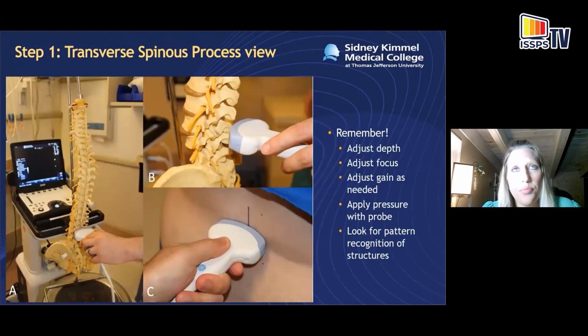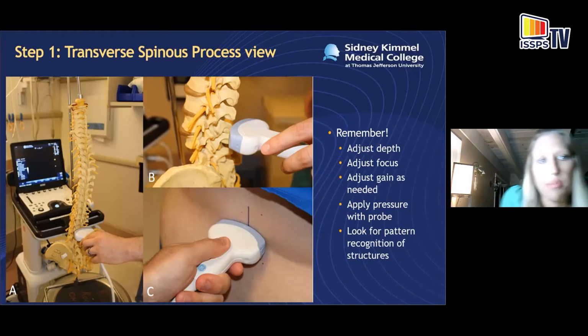So how I do it, it's important to remember all the different scans, and I know that was talked about in a previous talk, and I change it up a little bit. I know in general, most people will start with the paramedian or the sagittal views and identify the interspaces. In the obese patient, I find I can easily get lost trying to identify the lamina because the structures can be difficult to see. I usually just orient myself by finding midline, because I find that I can reliably find midline in all obese patients, while some of the other landmarks can be harder and take a little bit more time.